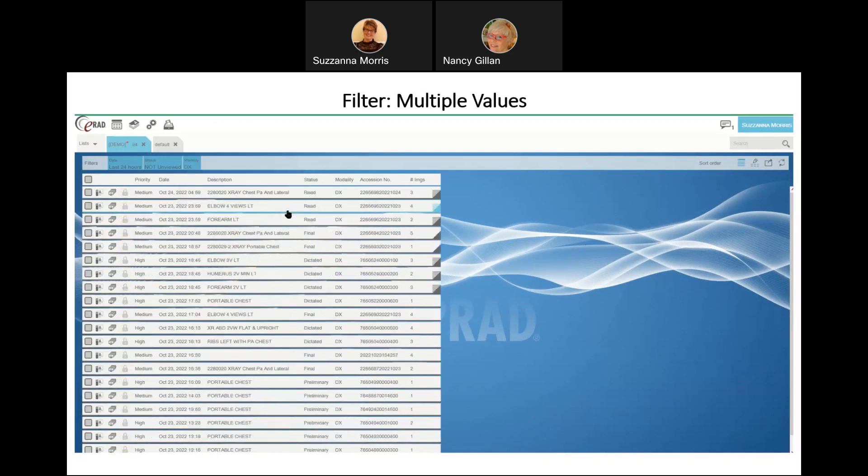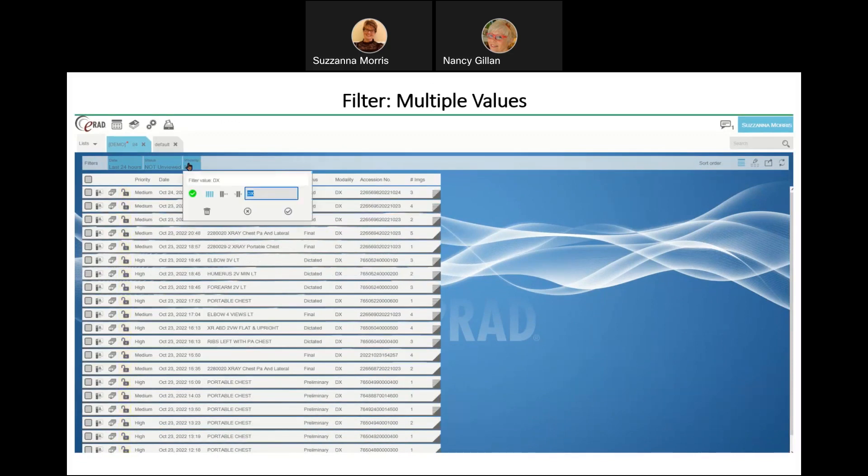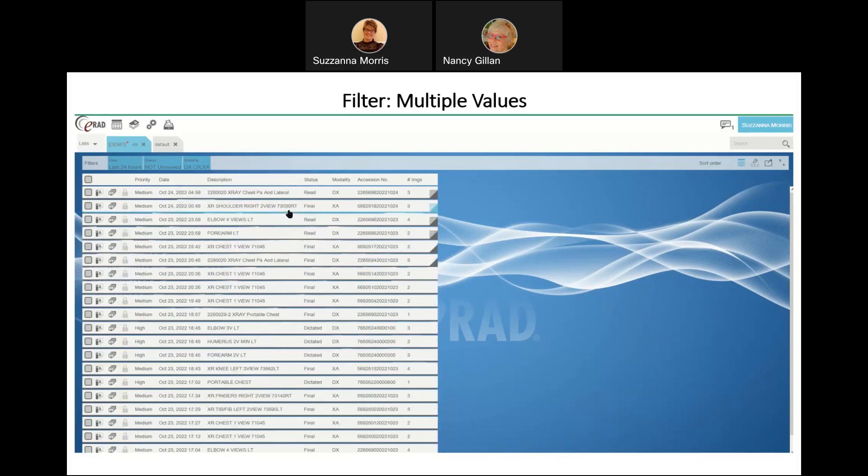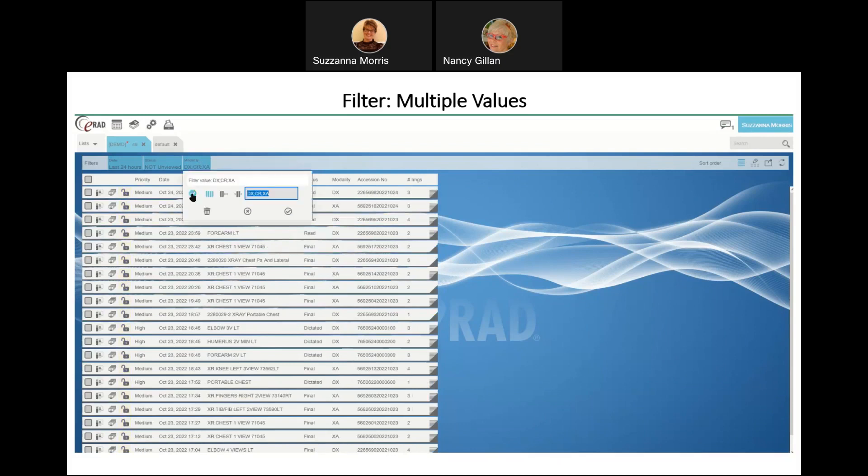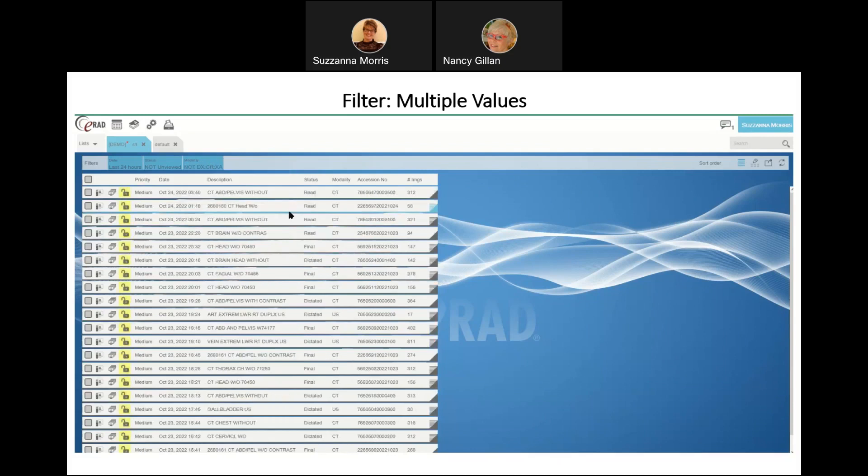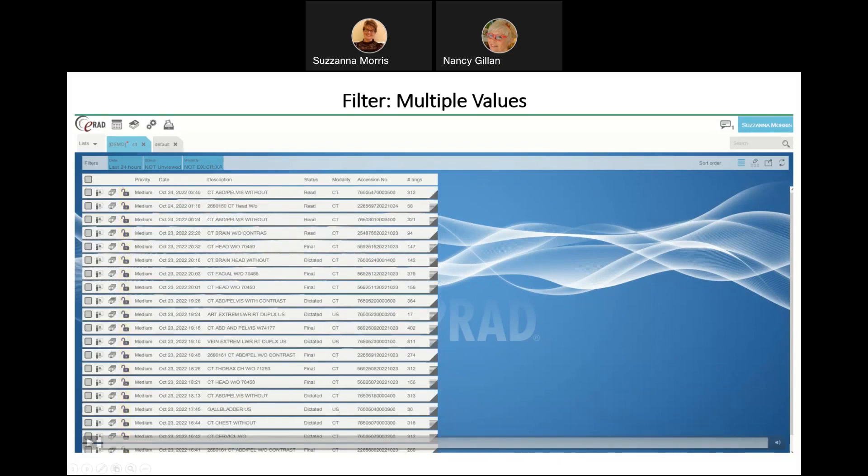For this example, I've pulled in DX only, and that's all that's displaying on our list. But if I wanted to include other modalities such as CR or XA, I would put a semicolon in between my values that I'm querying, and that allows me to filter by multiple values at a time as opposed to just one. If I wanted to see anything other than DX, CR, XA, I would again hit my checkmark, changes it to not, and as you can see now, we're only returning CTs and ultrasounds.